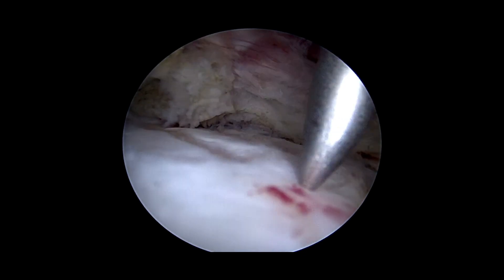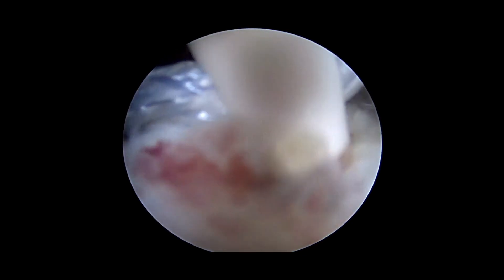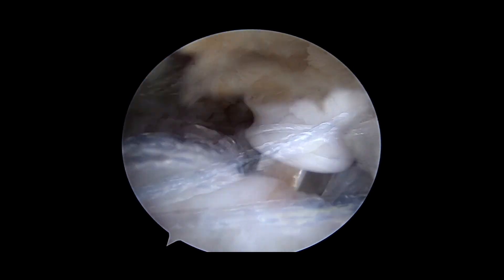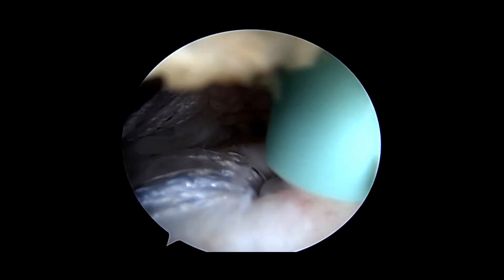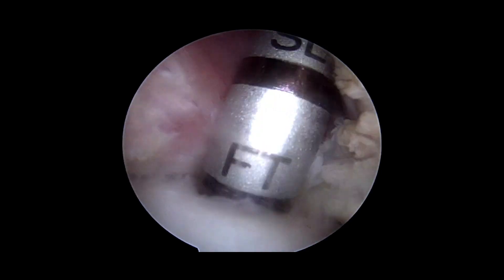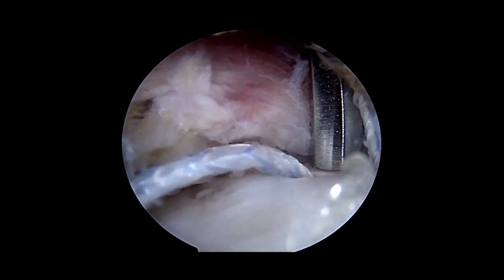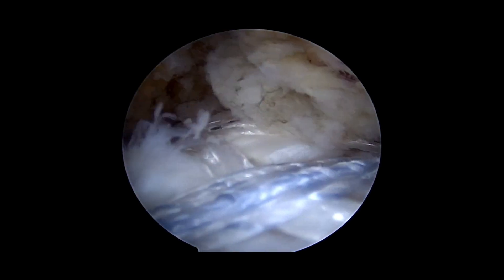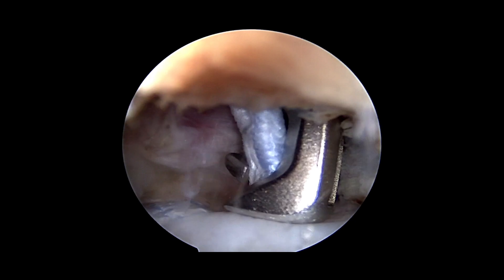The awl is positioned lateral to the posterior anchor. The hole is created and a swivel lock loaded with the tape from the front and back anchor is put in position. This is tightened to the right tightness and then screwed into position. The anterior lateral hole is then created. The tape is loaded into an anterior swivel lock, which is inserted. The tapes are tensioned and, when we're happy, screwed into position. The tape is then cut.